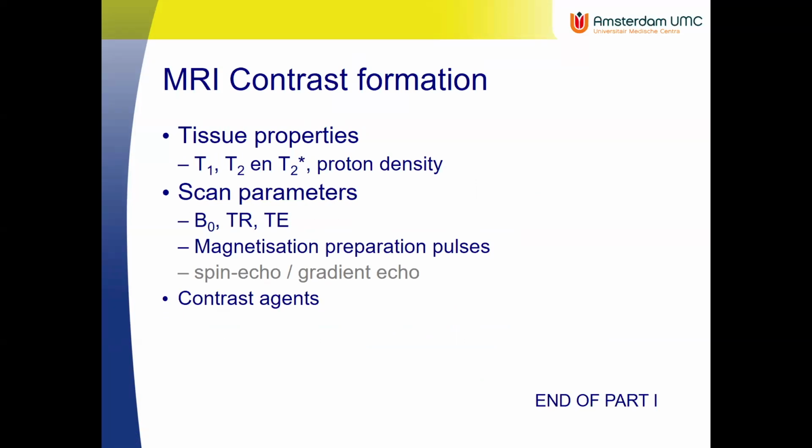Tomorrow you will play with the simulator, the MR scanner, and use all the information that we've shown today. And I think the table in my presentation showing the relation between the echo times and the different contrast weightings, T1, T2 weighted images, that slide is actually key to working with the computer simulations tomorrow.